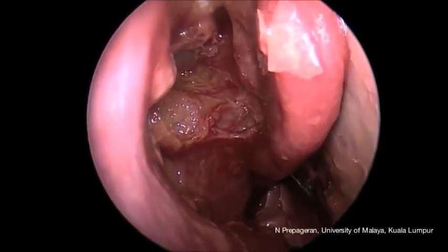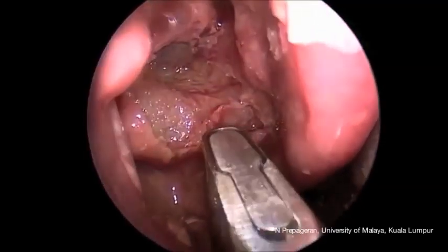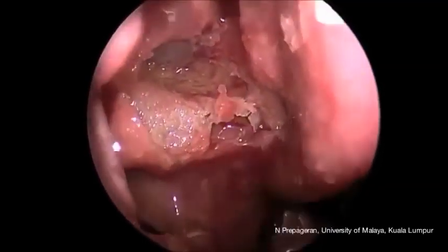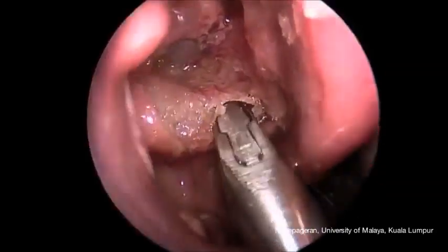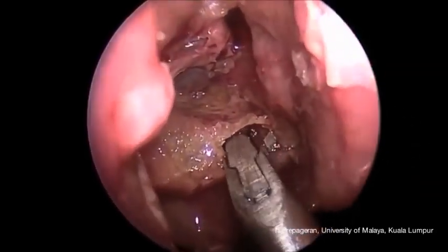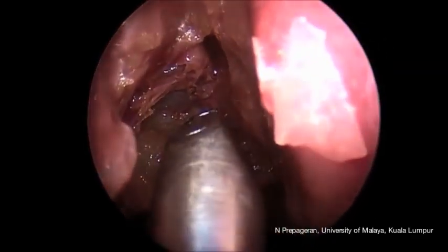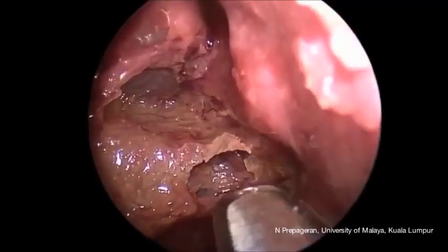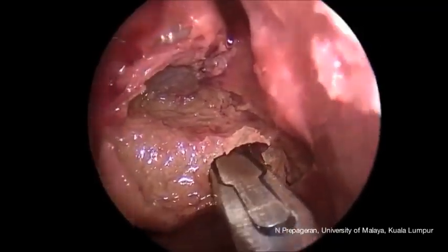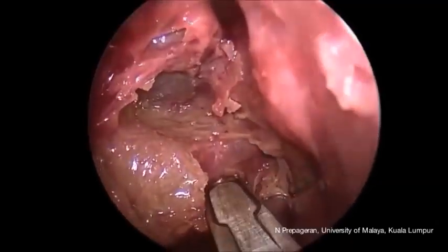So behind the ground lamella will be the posterior ethmoids. Again, you can see in some parts the ground lamella can be quite hard. To enter the posterior ethmoids, the best place is between the junction of the vertical and the horizontal portion. Again, we have to make sure that there's an air cell at the back. In some areas, it can be quite tough. Use an instrument, make sure there's an air cell at the back.